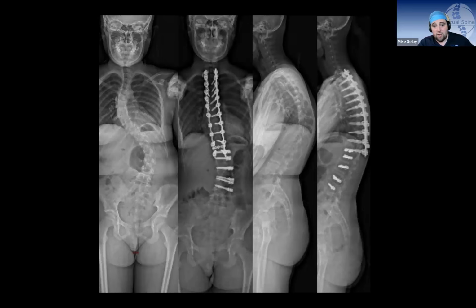Simak, what do you think? Yeah, very nice. Did the wrong thing or did the right thing? Beautiful. Good results so far. You exactly did what you wanted to achieve. So the patient is still growing and you want to have that self-correction by putting the tethering. I think that's very nice. Yeah, it's sort of like your knee. It's working okay.